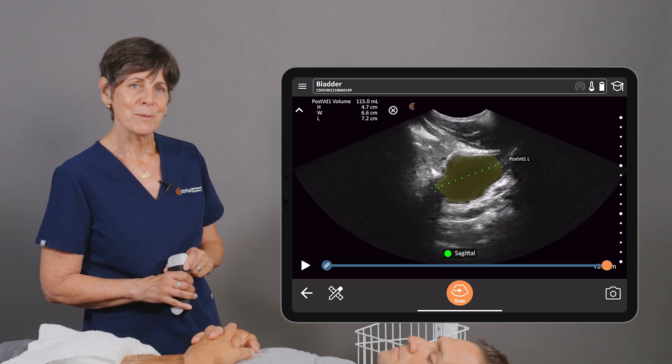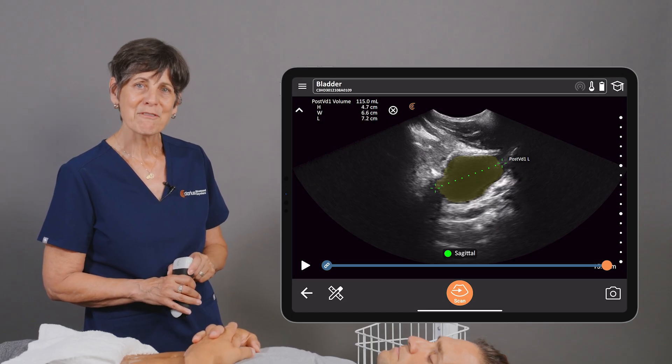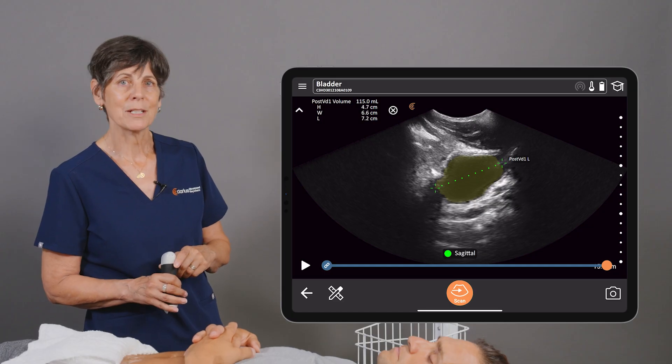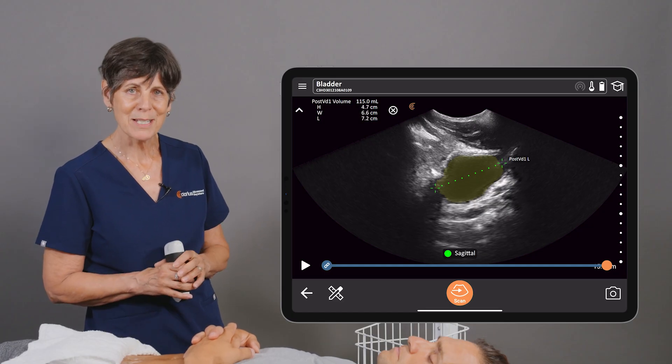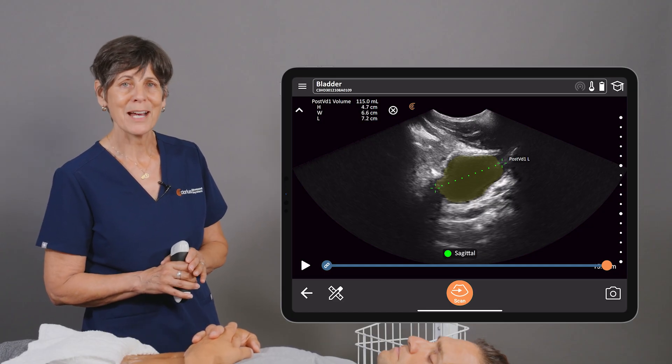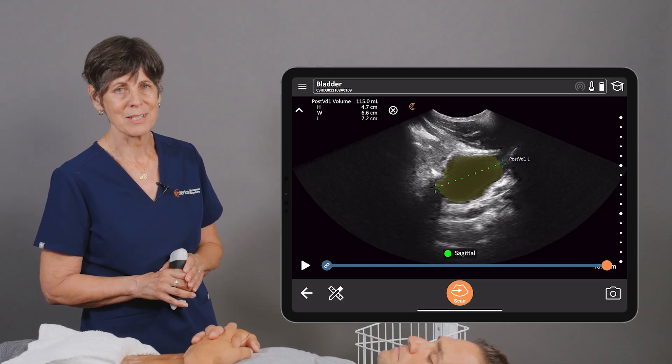So if you make a mistake and forget, or you just decide you want to maybe confirm your measurements using the AI, you can still do that on your stored images.